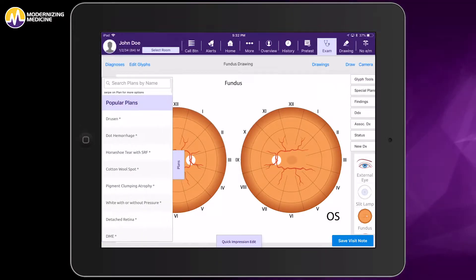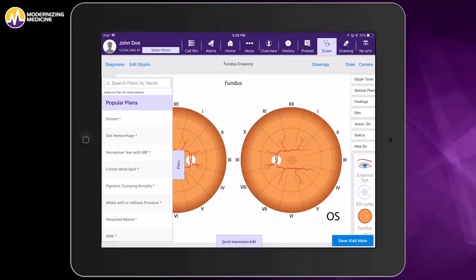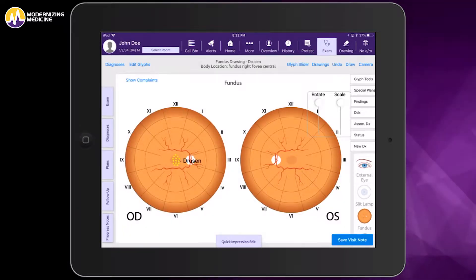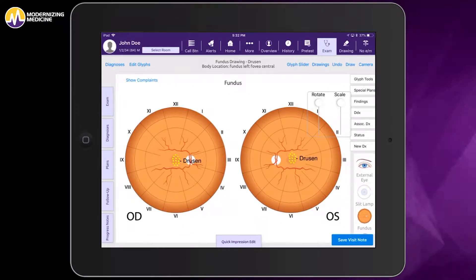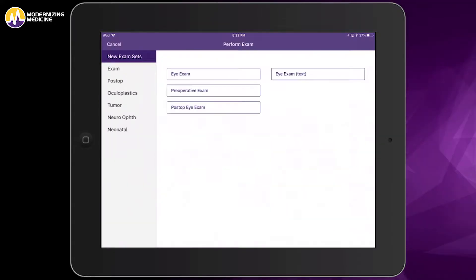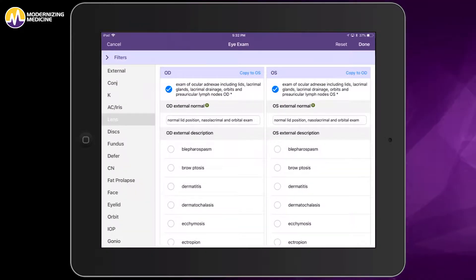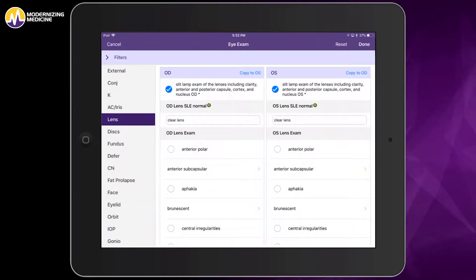On the left-hand side, you can see our adaptive learning engine at work. This list includes the items that I draw most frequently. I'll go ahead and select Drusen, and I'll place those Drusen in the macula of both eyes. Our EHR labels the color drawing and will backfill the finding in the exact location in my exam.